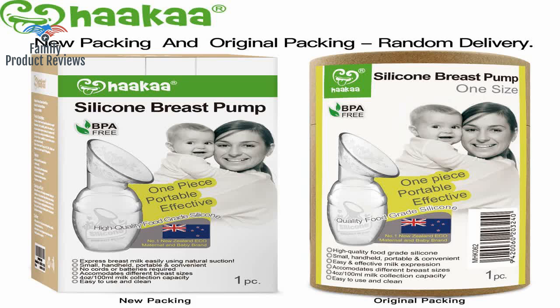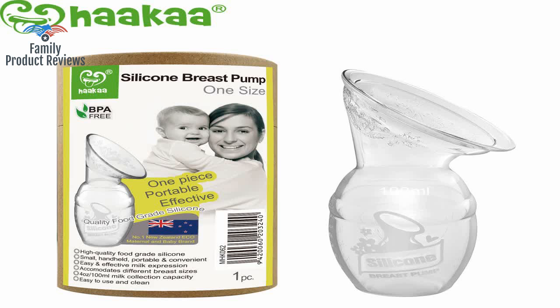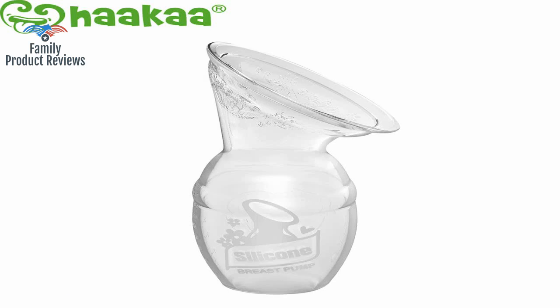The Hicca has thicker silicone and the opening of the neck of the pump is a bit wider. It was gentle and easy to wash, and not a hassle like most breastfeeding pumping products.